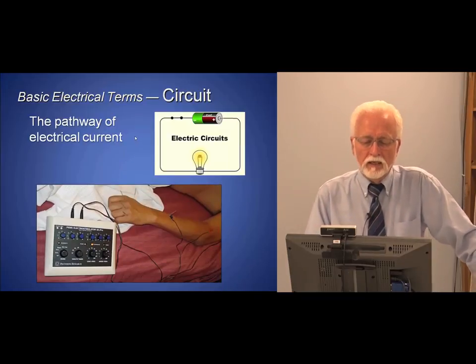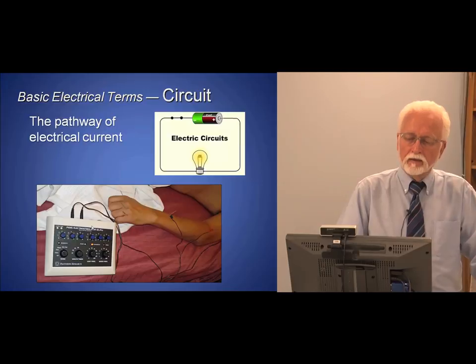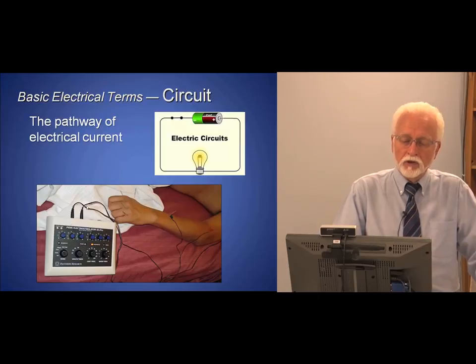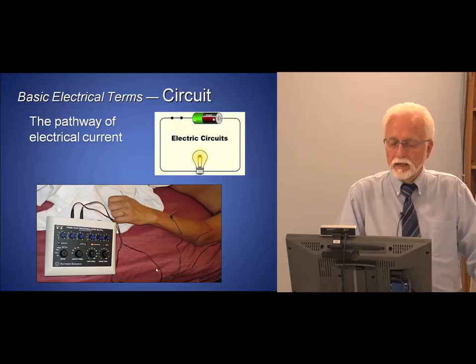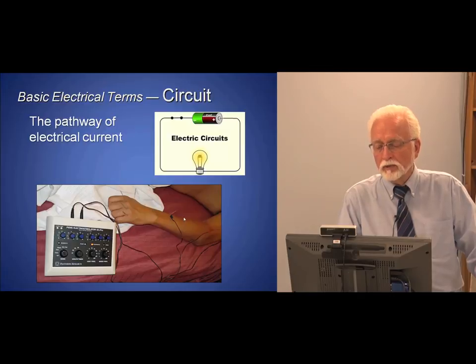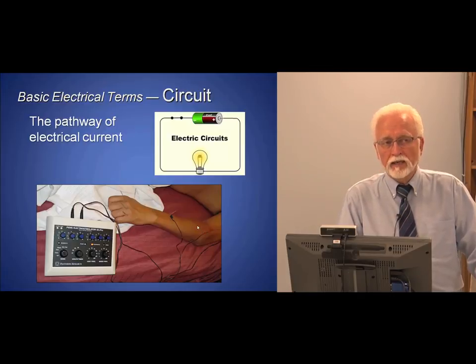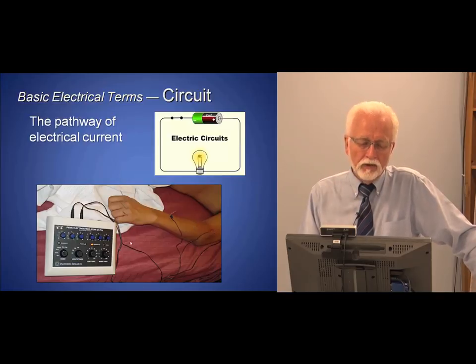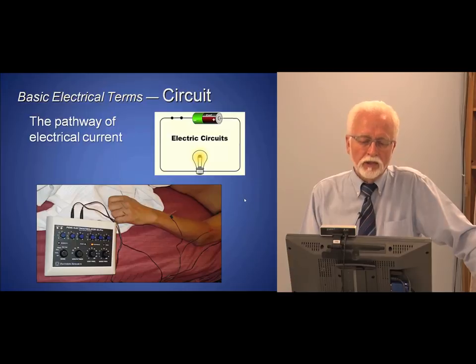Here you can see a similar concept. The battery is encased in your electroacupuncture device. You've got a circuit hooked up and plugged in, and there are actually 2 little wires coming out here. It goes around and comes in to the negative and then through the patient. So the light bulb is here in the patient's body. The patient is where the work is happening, and then it goes back on the positive side. That's the electrical circuit through the patient.